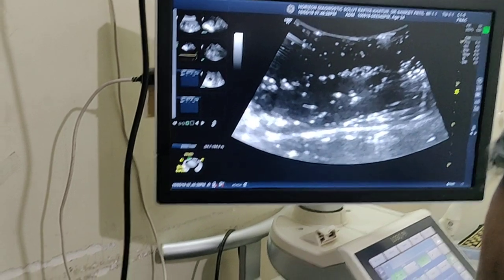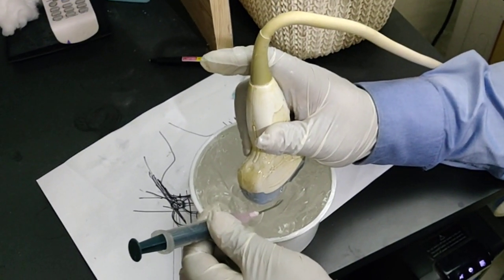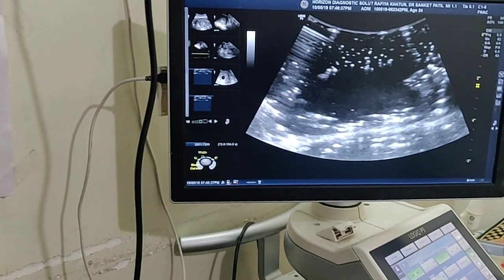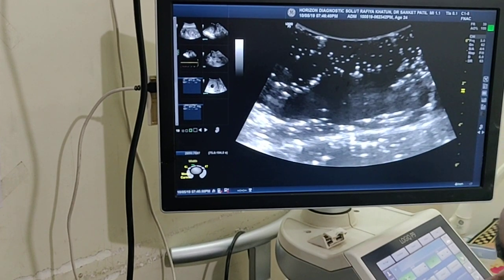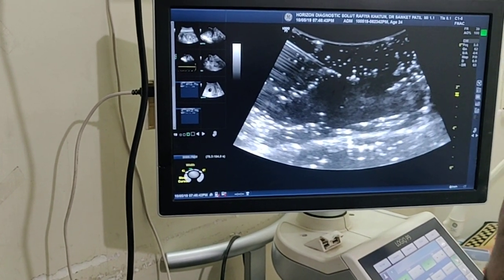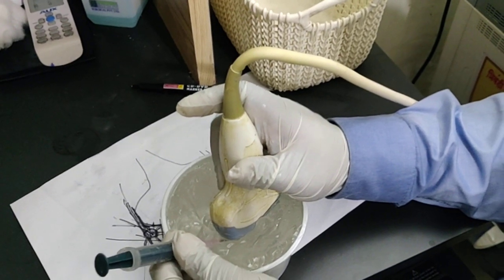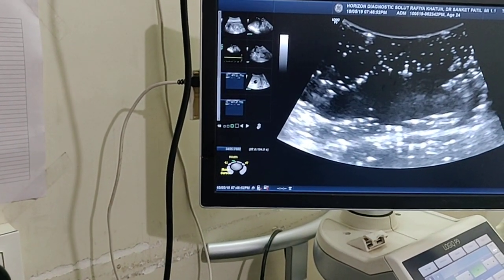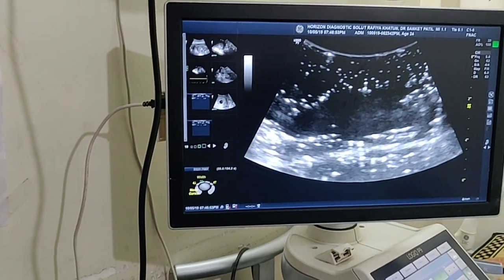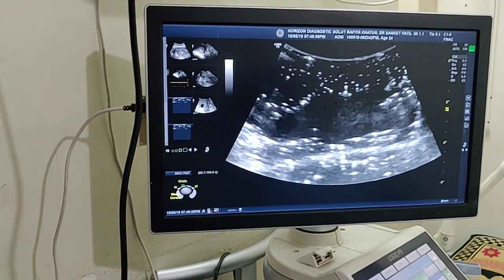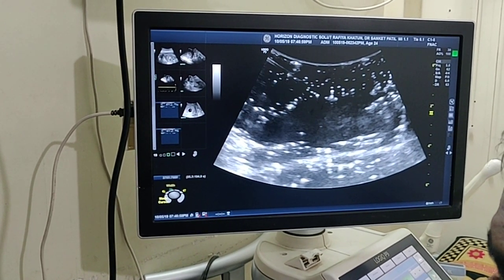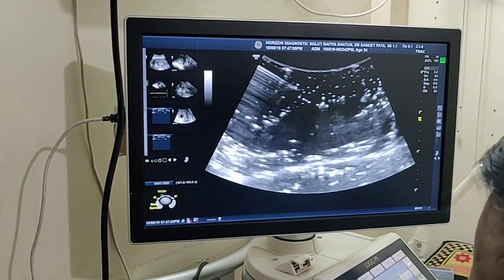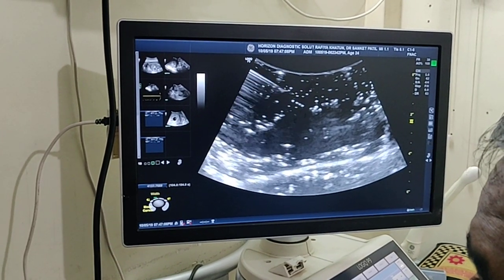We have to progress further. Now it is nicely seen on the screen. If it is put nearer to this part, it is seen on the screen. Now I am coming closer — see, this is seen and this is gone. It is still under the probe but not seen. And when it comes to the back side, it is seen on the screen. So this is the trick.